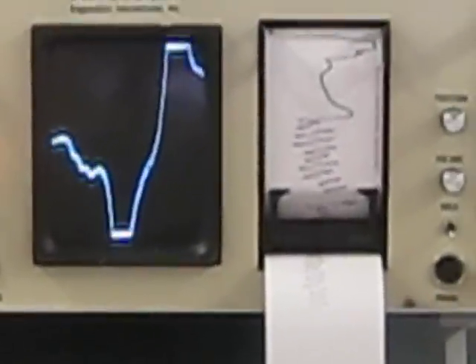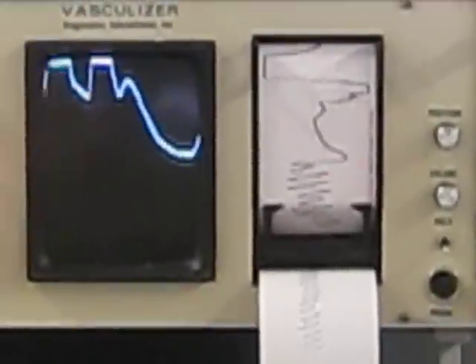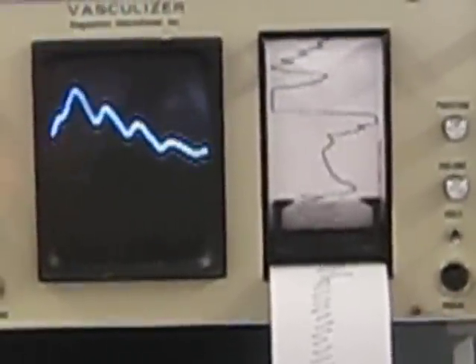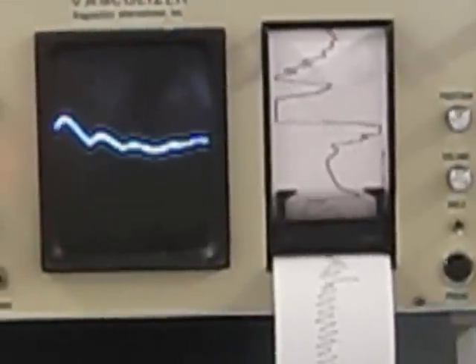Bring your hand back down to position and take a deep breath in. Hold it. We are now in the fourth position and you notice that there is a small amount of wave coming back but still very diminished.